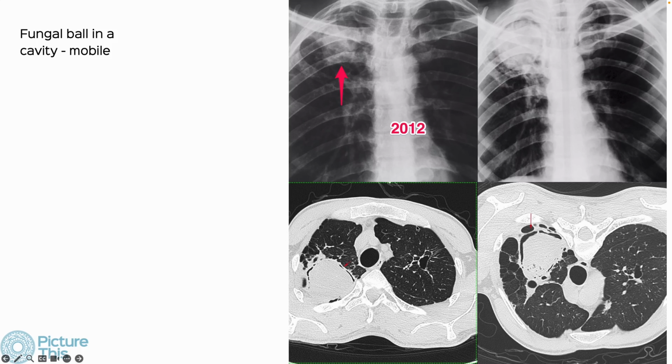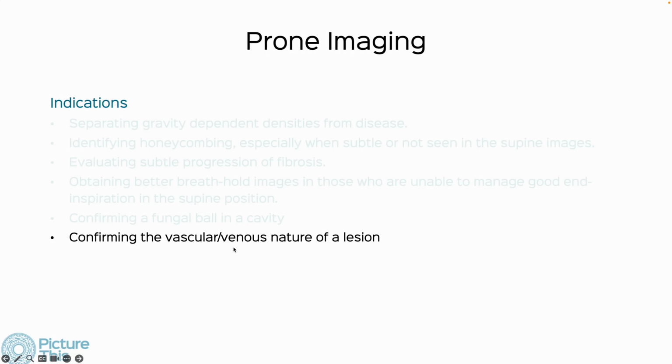And then confirming a fungal ball in a cavity. We've always known that. So whenever you see soft tissue within a cavity, it's a good idea to take a prone image and make sure it's mobile, etc. And this is, of course, very rare.